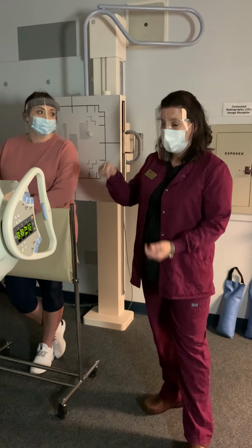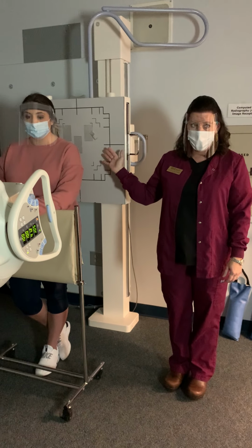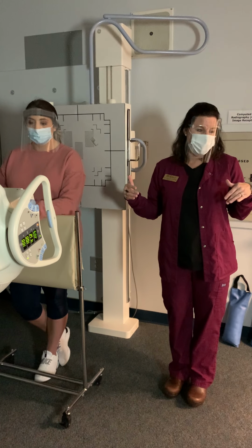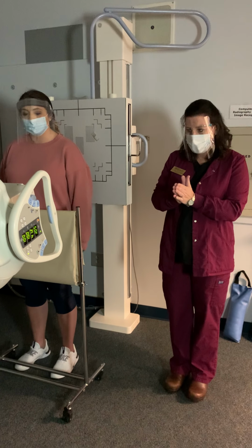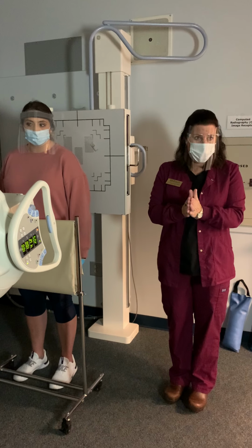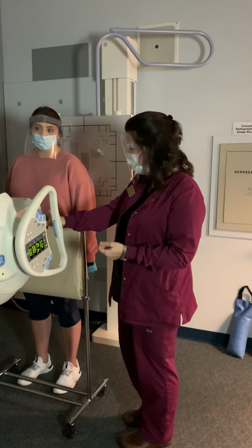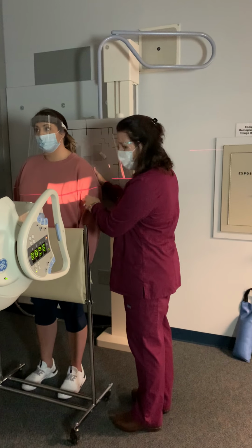You can do that and angle 15 degrees, or you can just put them just like they were for the AP patient. Most commonly, we angle 15 degrees for clavicle. The book does tell you if the patient is really small, you can go up to a 30-degree angle. The smaller the patient, the steeper the angle. We're going to stick with a 15-degree angle here. I'll bring you back over. Still have to center.